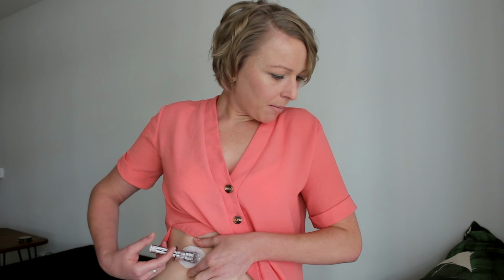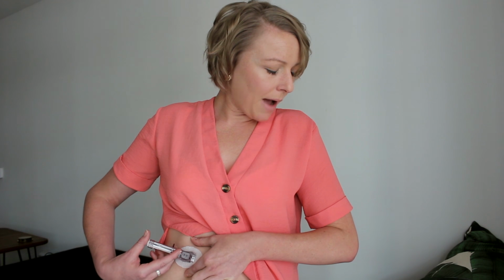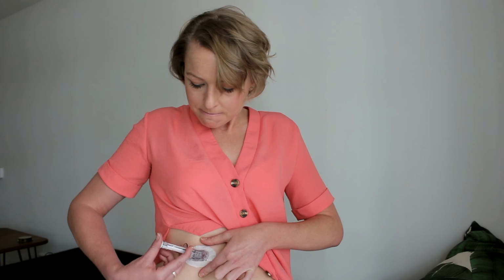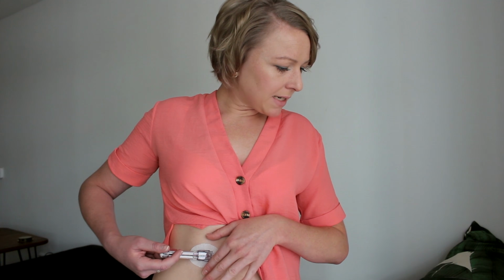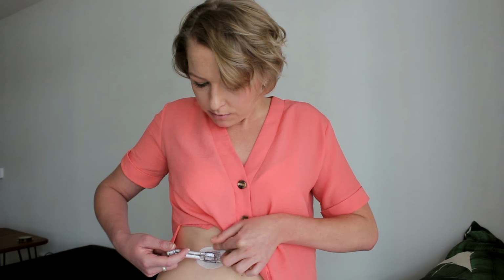Slightly awkward. Move your 2 fingers from above the collar to below the collar. Pull the collar back towards your thumb until you hear 2 clicks, or you cannot pull back anymore. All right. Squeeze the ribbed tabs on the side of the sensor pod. Okay, right, I can see the ribbed tabs.